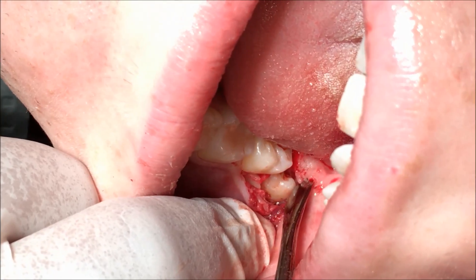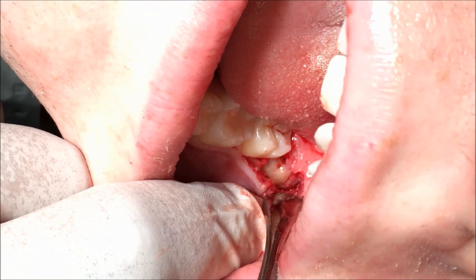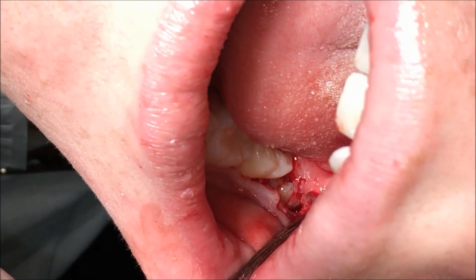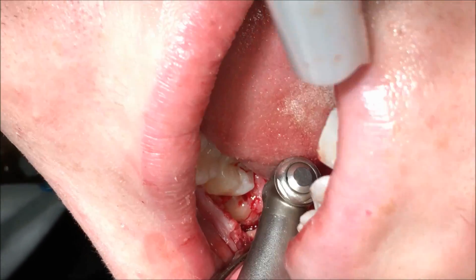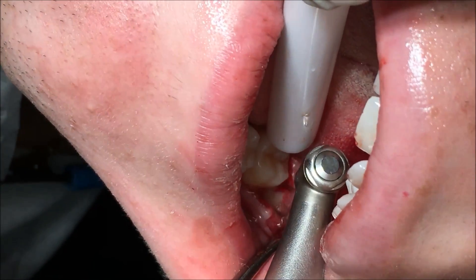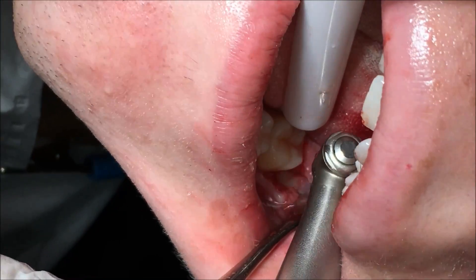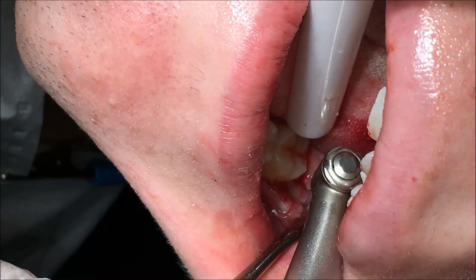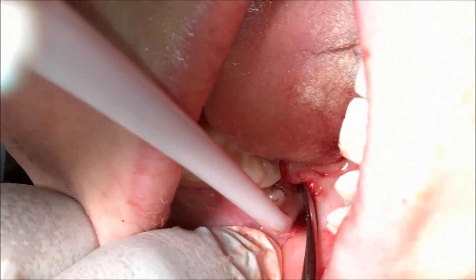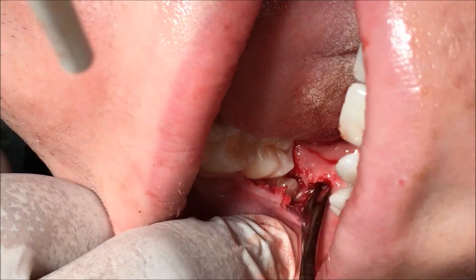You can see me just showing the distal there. A little bit more removal — I'll just take a bit of that distal bone. There goes that distal bit of bone.